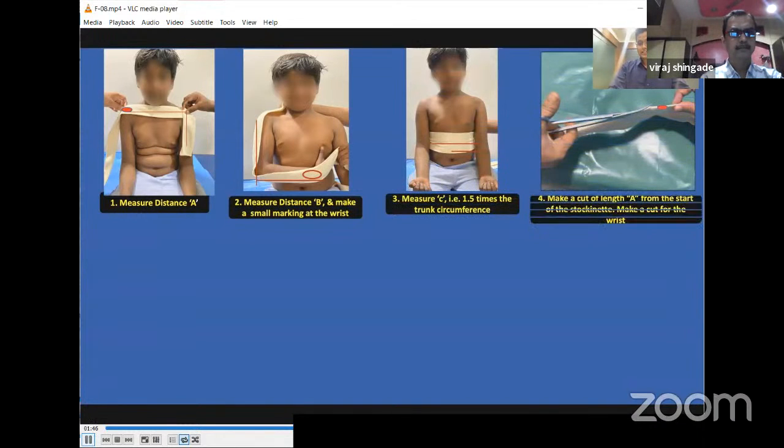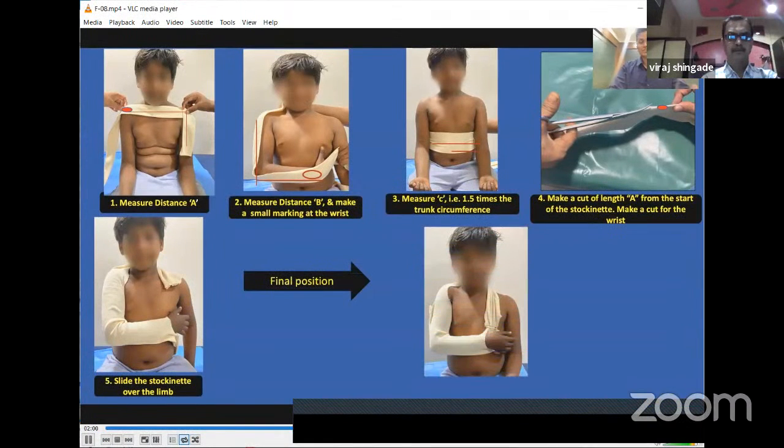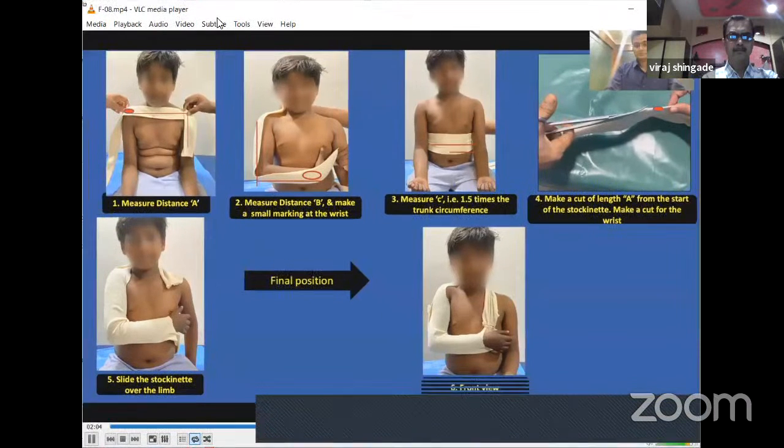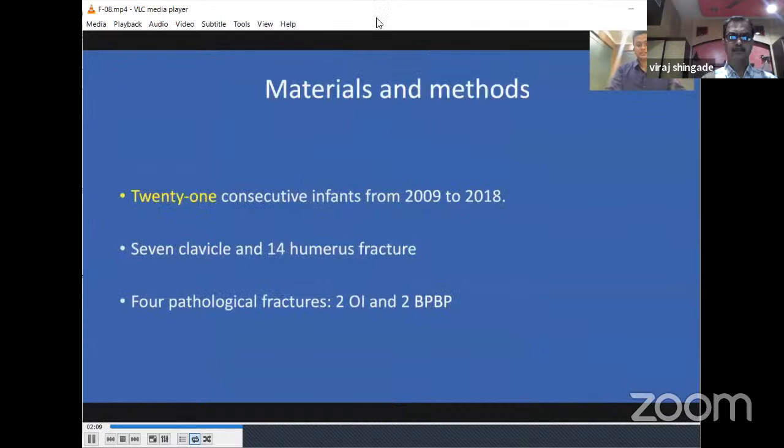Then, in the next step, make a cut of length A from the start of the stockinette, and we also make a cut at the wrist area, and the wrist is taken out from the stockinette. The remaining stockinette is slid over the limb in the pre-pinning position. In the final position, with the help of the 2 safety pins, we pin the stockinette at the wrist area and at the arm area.